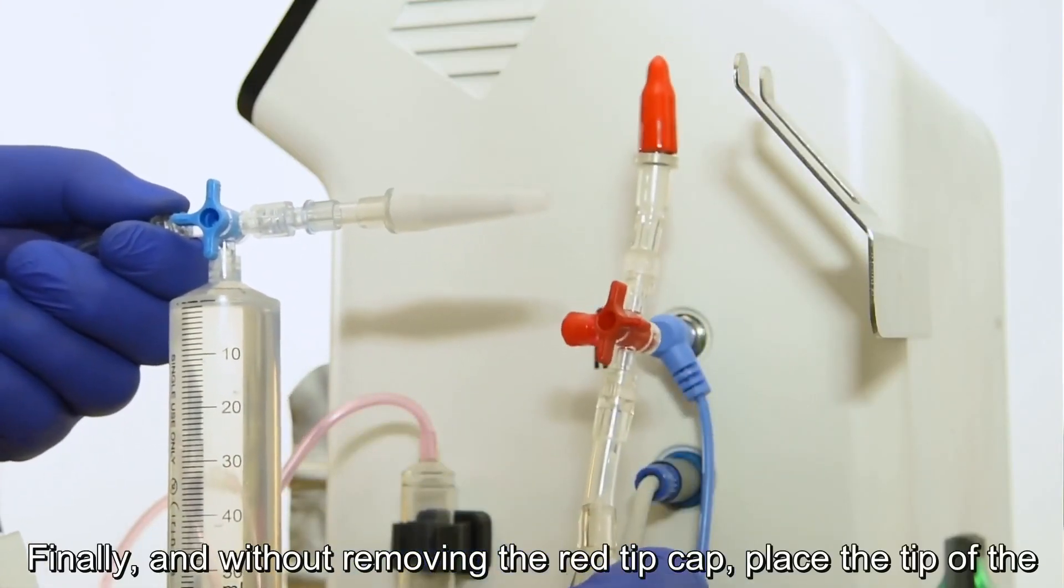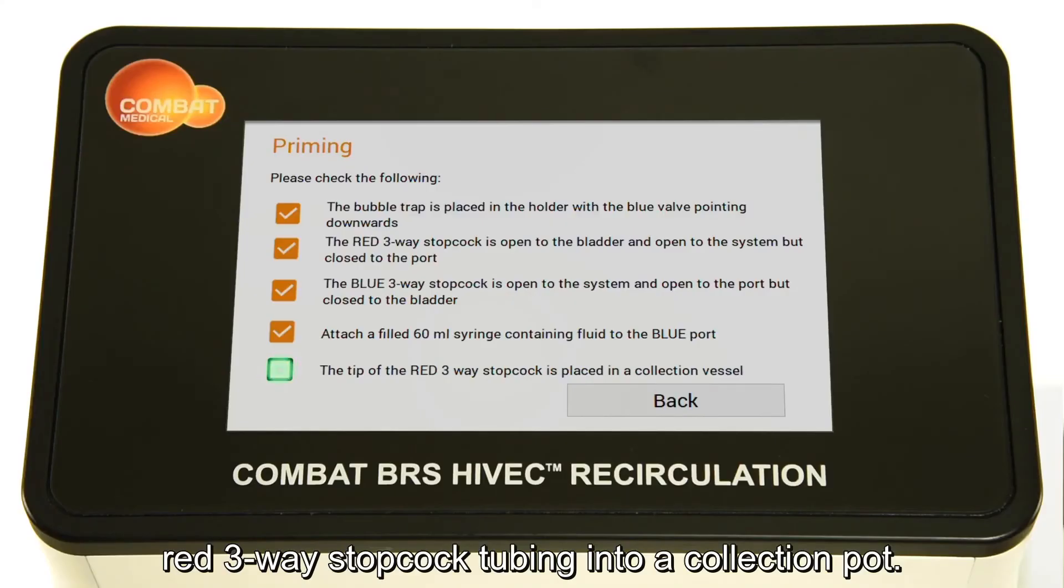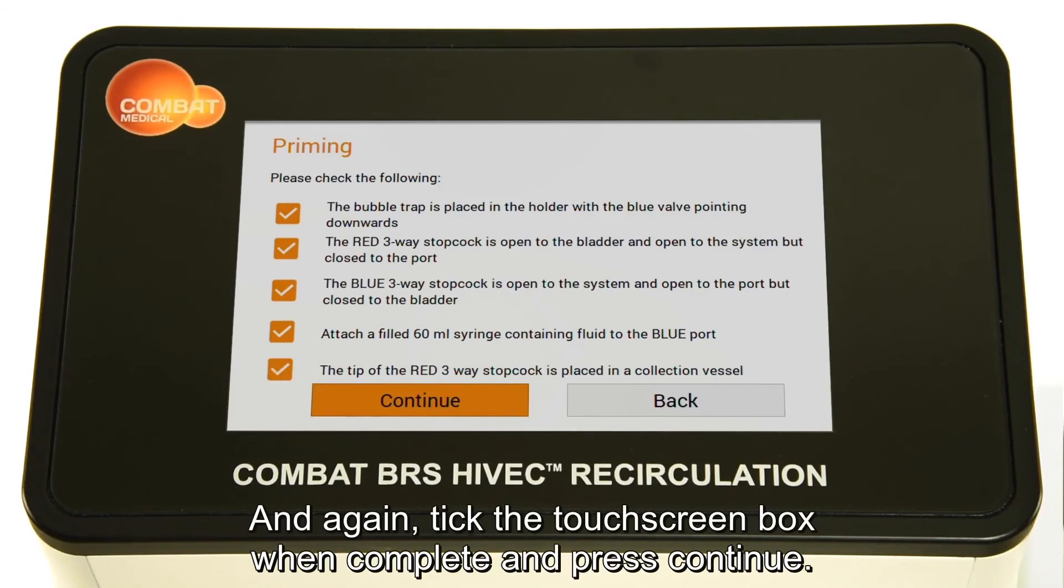Finally, and without removing the red tip cap, place the tip of the red three-way stopcock tubing into a collection pot. And again, tick the touch screen box when complete and press continue.